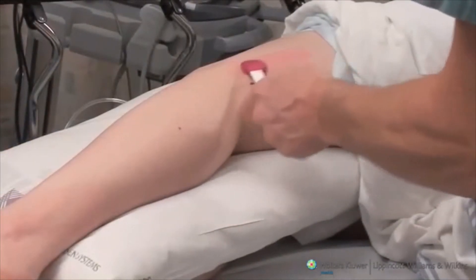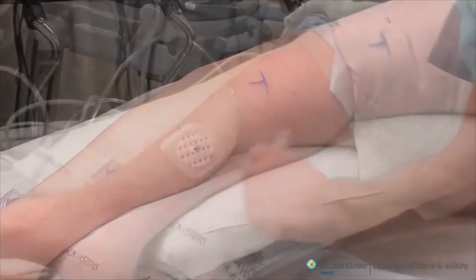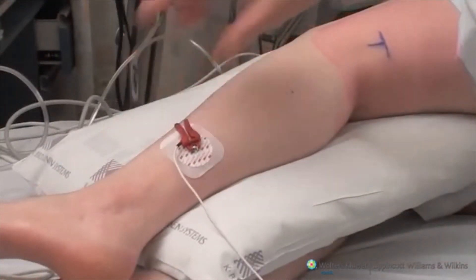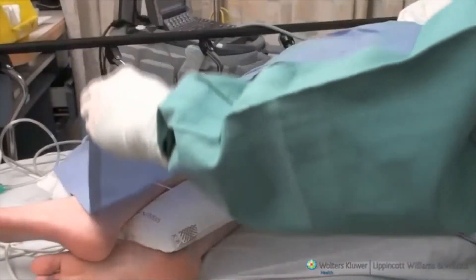The entire popliteal area is then prepared in a sterile fashion prior to performing the block. An electrical nerve stimulator is attached to the patient and the area to be blocked is covered with a sterile drape.